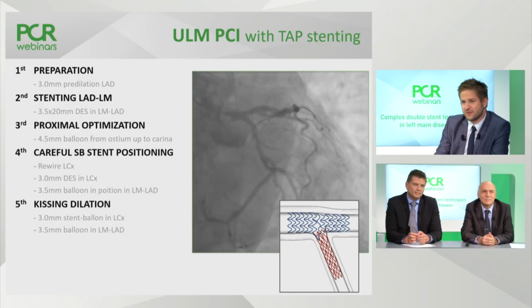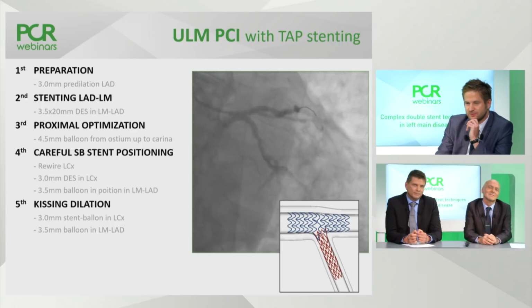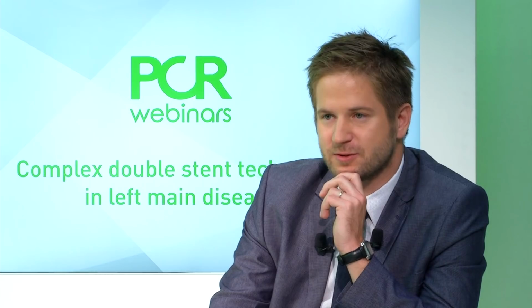So we stented now 2 patients in the left main. Chris, would you have any special consideration during the discharge of these patients regarding, for instance, follow-up or double antiplatelet regimen? Let's say this is a normal smooth case, like we just saw 2 very nice cases from Marko. I just follow these patients up like I would usually do, no follow-up unless clinically indicated. Dual antiplatelet therapy depends also on the patient. If I have a patient like this, I would follow the normal 6 months regimen.